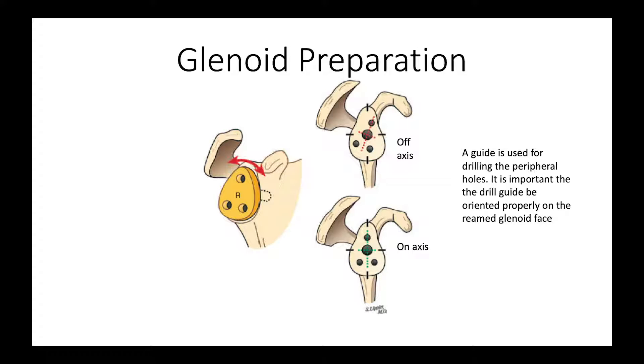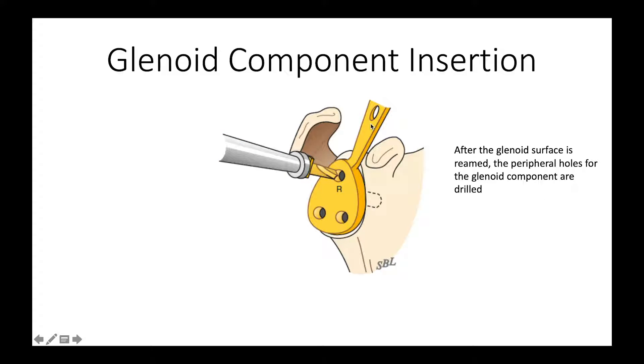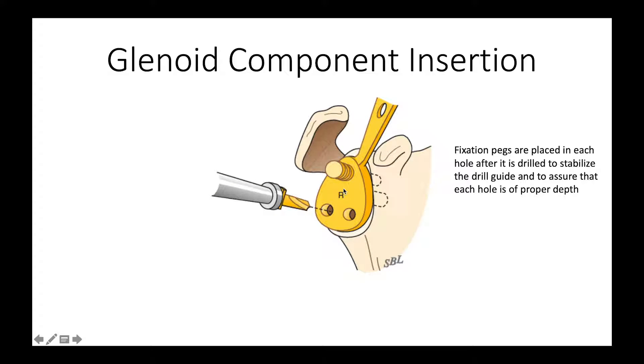When we get ready to drill the additional fixation holes, we want to make sure we have everything oriented on the proper axis because that's where the bone is the best. Once we've achieved the axis orientation we desire, we drill the peripheral holes. Each time we drill a hole, we put a peg in there to secure the drill guide to the bone, which also assures that we maintain the proper rotation of the drill guide.